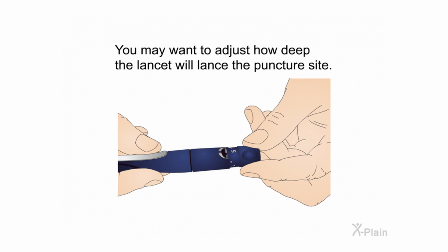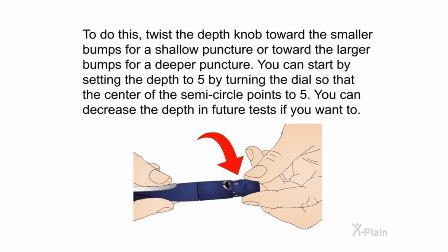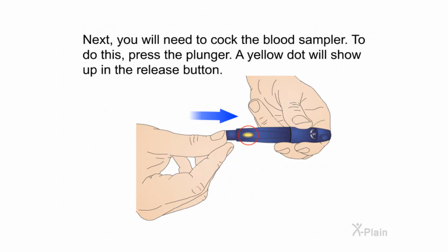You may want to adjust how deep the lancet will lance the puncture site. To do this, twist the depth knob toward the smaller bumps for a shallow puncture or toward the larger bumps for a deeper puncture. You can start by setting the depth to 5 by turning the dial so that the center of the semicircle points to 5. You can decrease the depth in future tests if you want to. Next, you will need to cock the blood sampler. To do this, press the plunger. A yellow dot will show up in the release button.